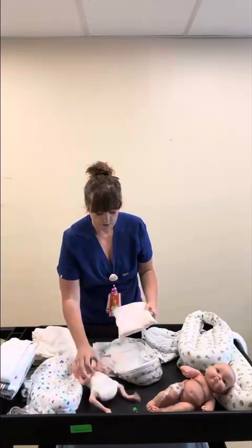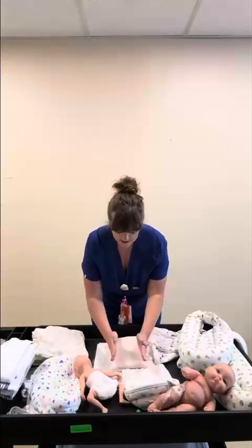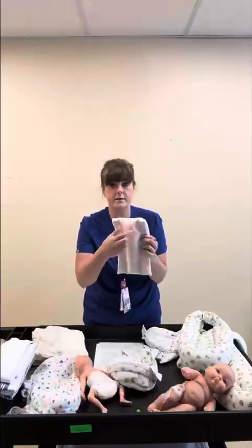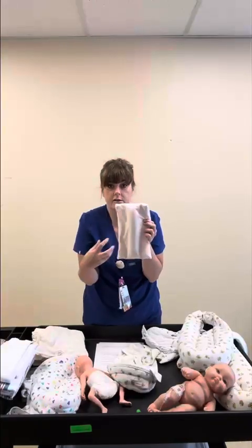Other things you can do is to create a little teeny skinny one by smushing just the middle together, and you've created this middle channel here to make a smaller prone positioning device. So these are super moldable. They have no memory, so you can do it over and over again and start from scratch till you get in the right position.